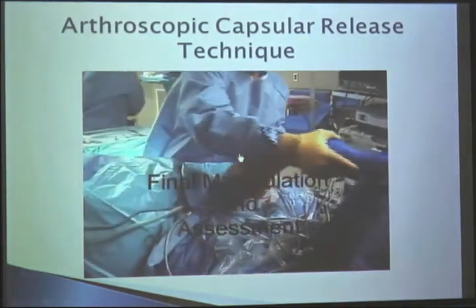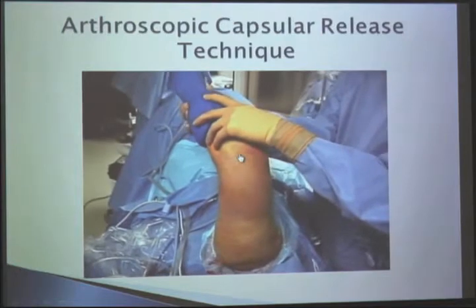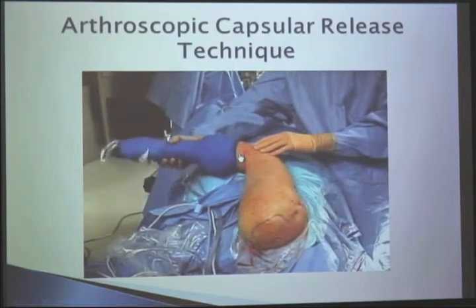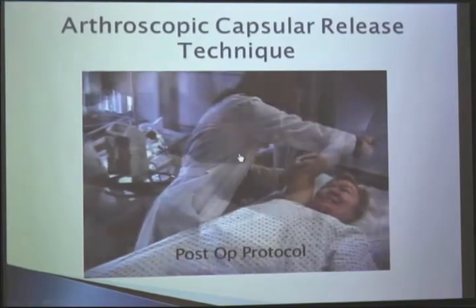Subacromial space, as you just saw, is rarely involved, so I don't do a decompression. And then we manipulate at the end. Rarely do you get a whole lot more, because even if you don't use a pump and you just let it run on gravity, and even if you do it in a timely manner, extravasation usually precludes your ability to manipulate much better or see where you are.